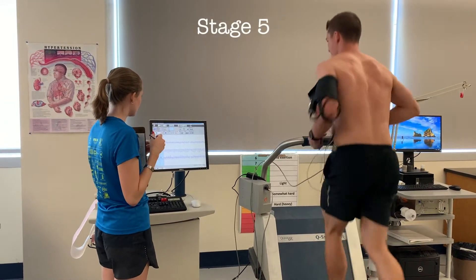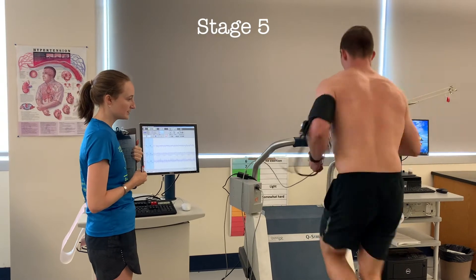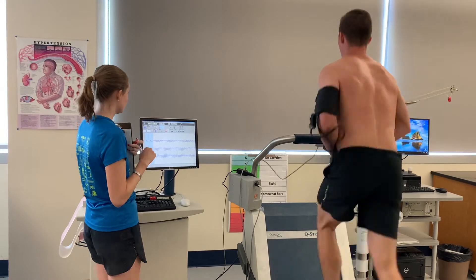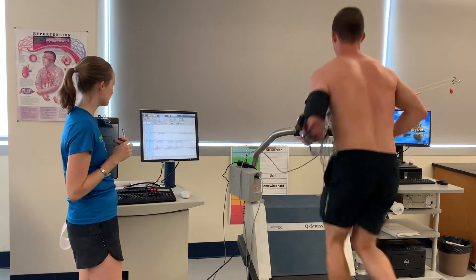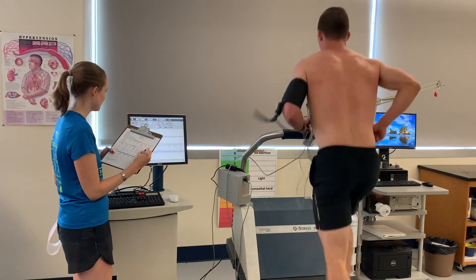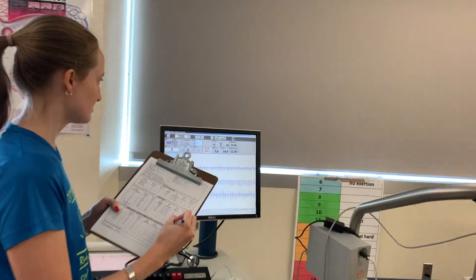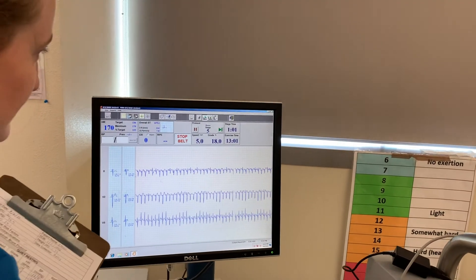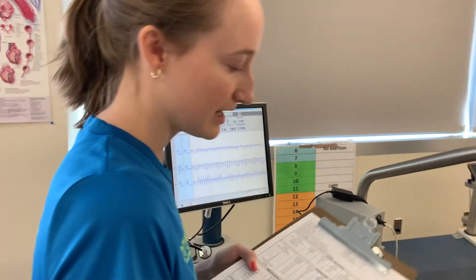Doing really good — you're going up to that next stage. Pick up that pace. Nice job. Keep it up, you got this. Get higher on that treadmill if you can. Good work. Almost there. And we were at 13 minutes exactly — go ahead and lay on down.